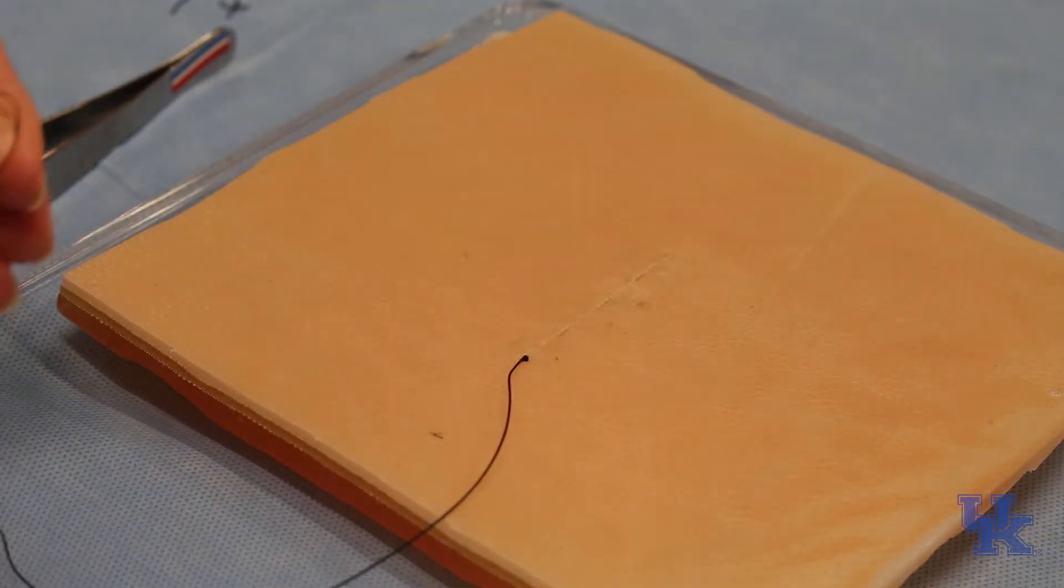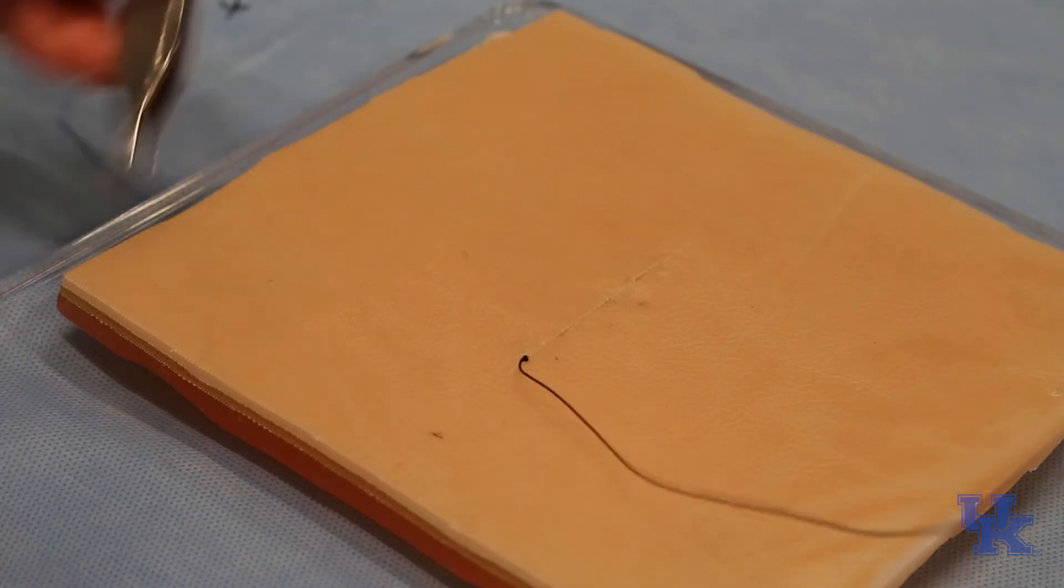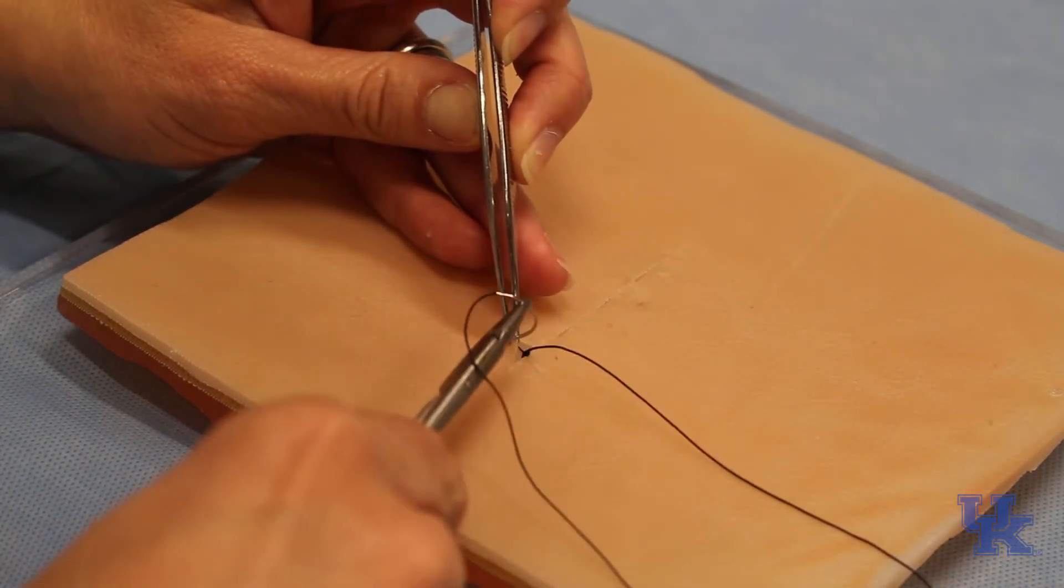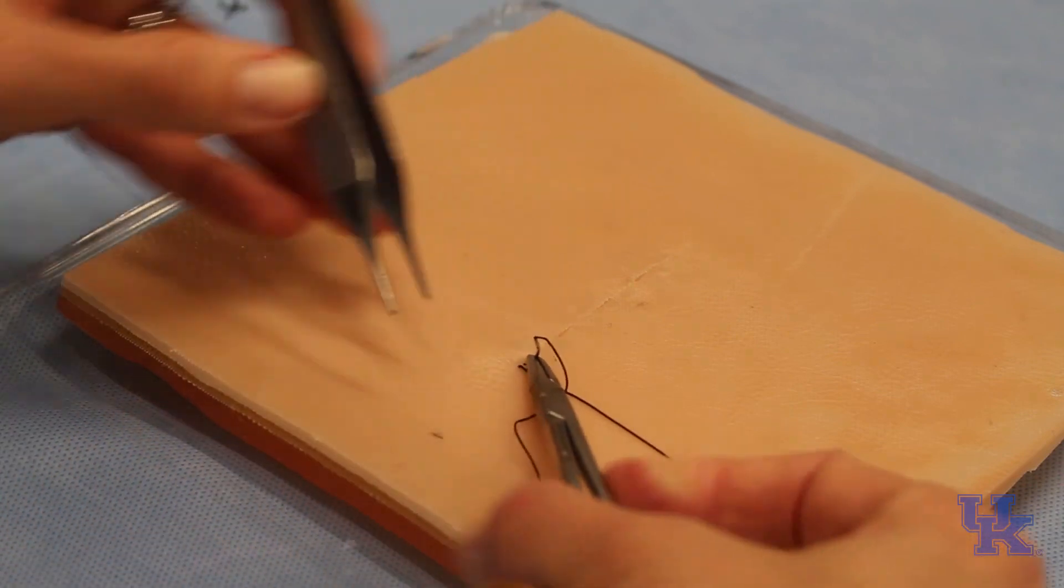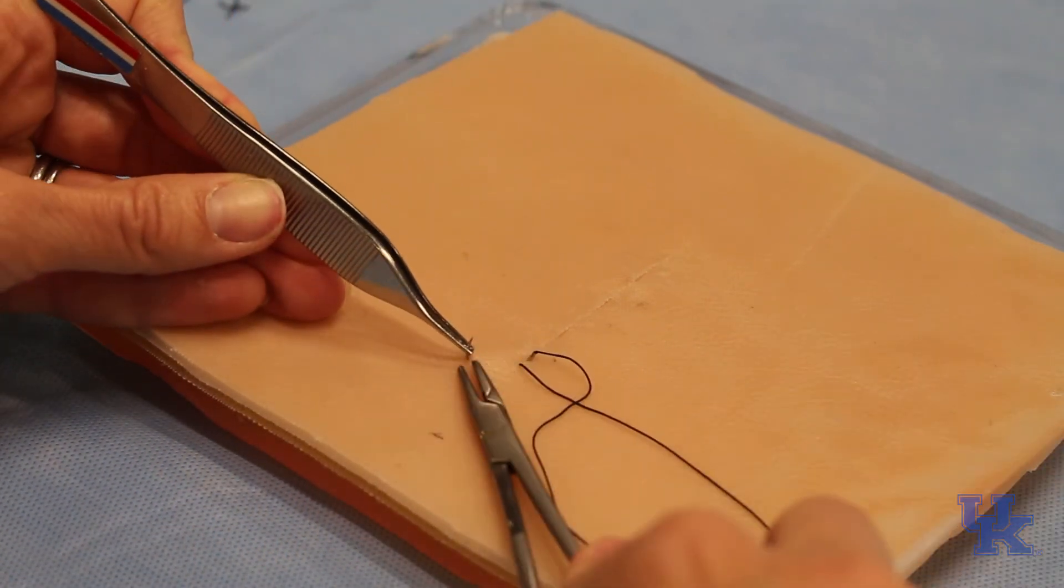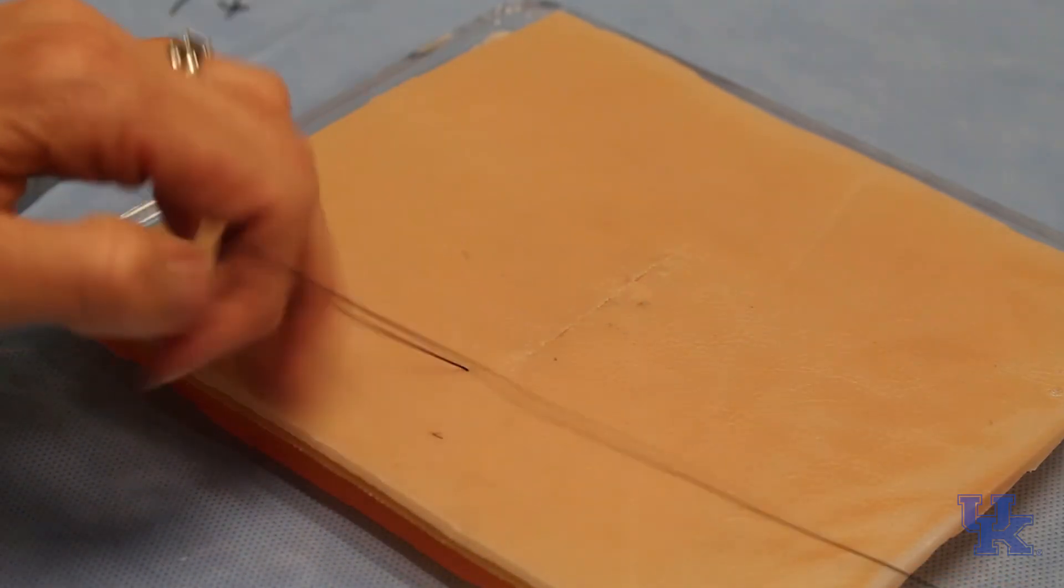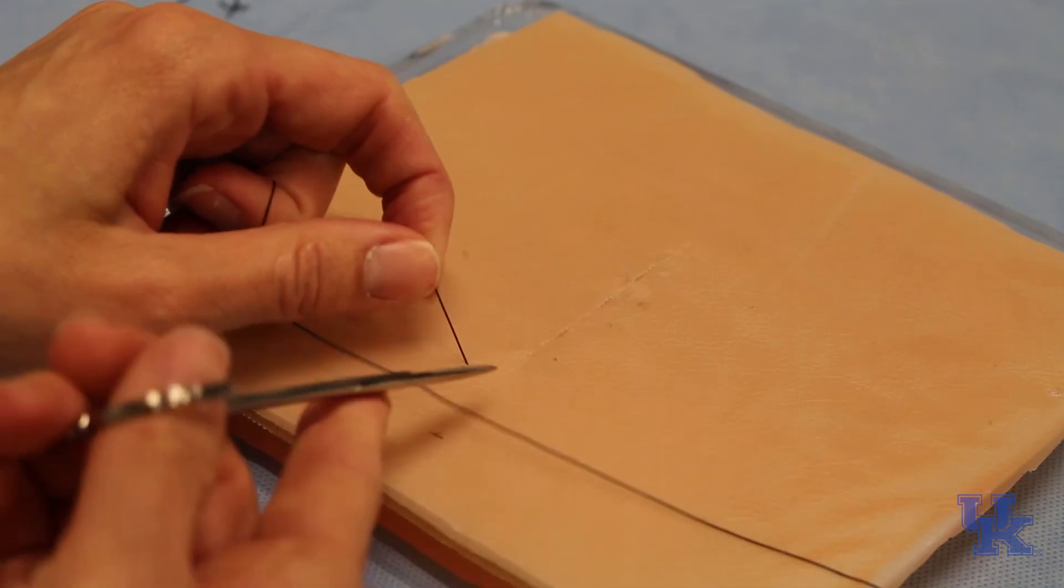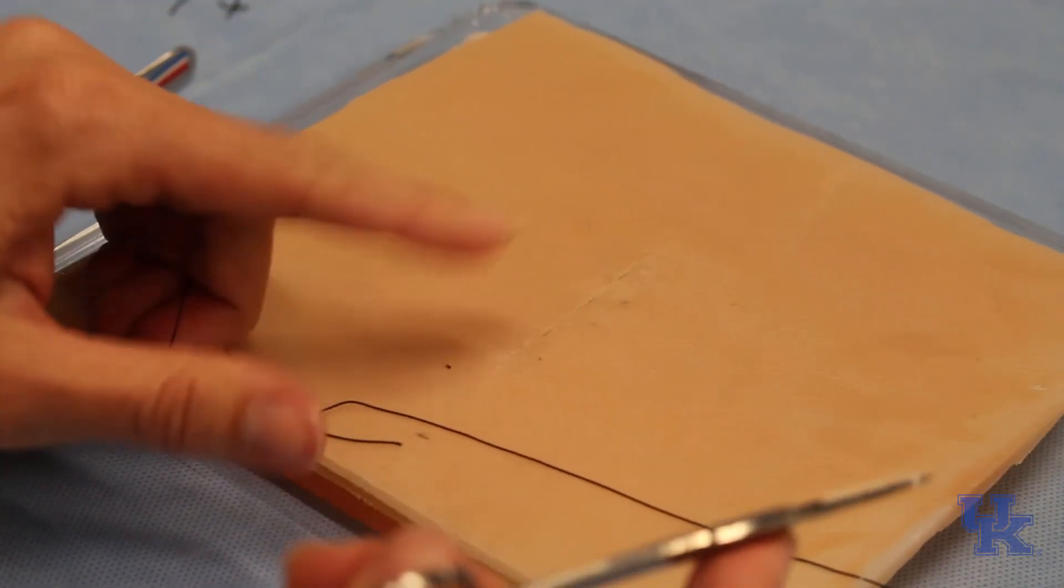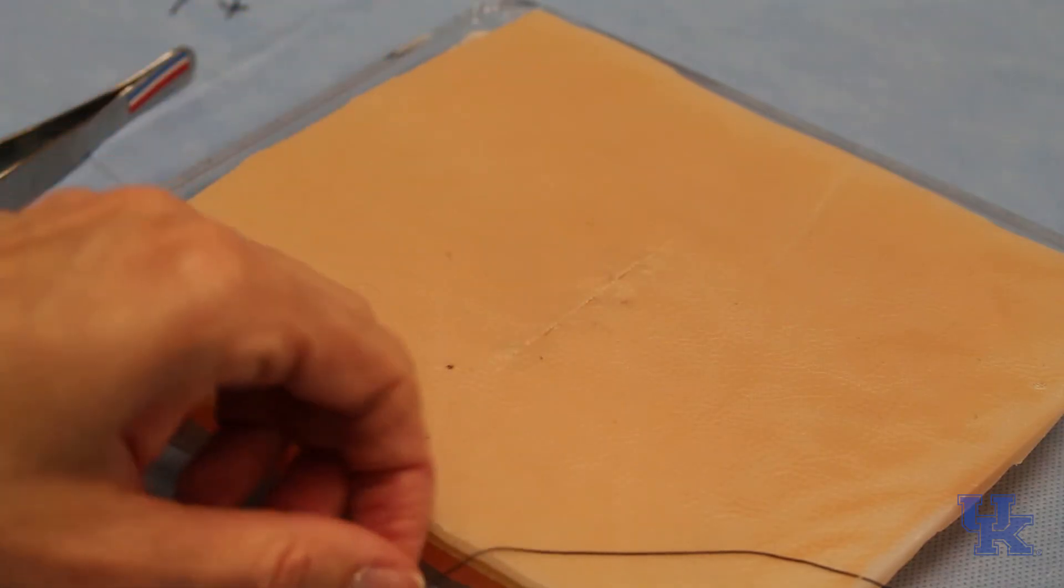Now, in order to make the knot go down where we know it's anchored, to bury the knot, I'm going to take this, and I'm just going to stick this down where I know that knot needs to go, and I'm going to come out somewhere beyond the incision, and that will bury the knot. Then you'll hold this up and just cut it flush with the skin. There we go, and then you have your whole closed buried suture. That's a subcuticular closure.